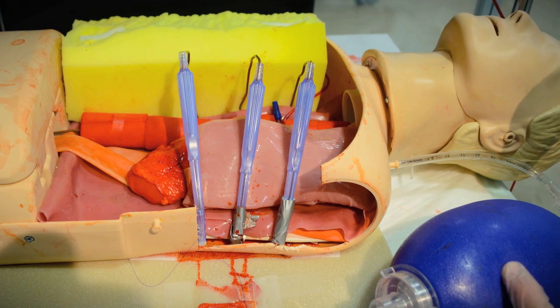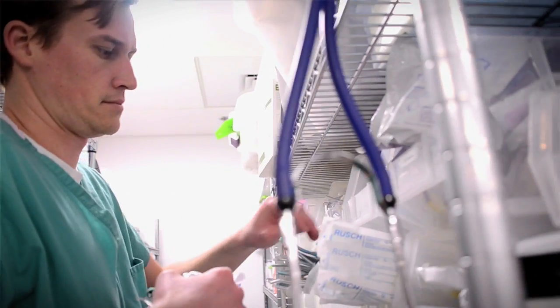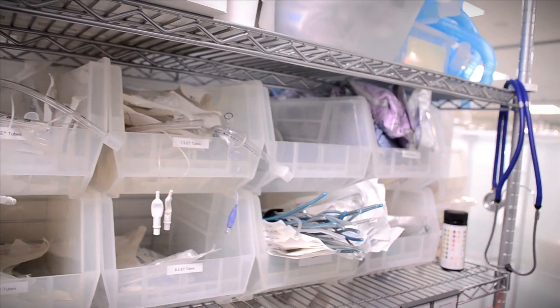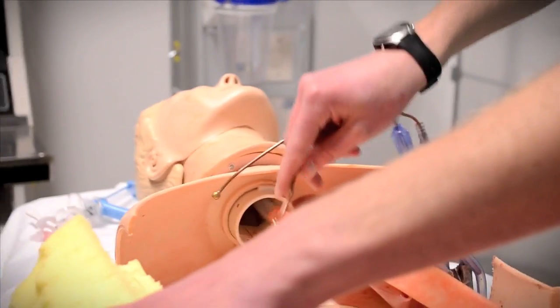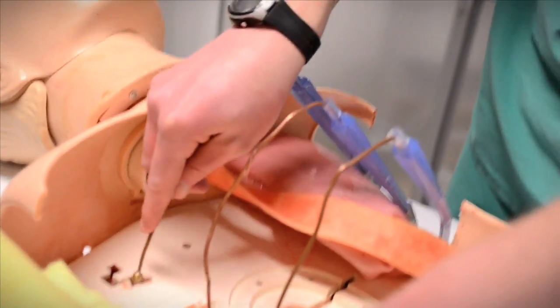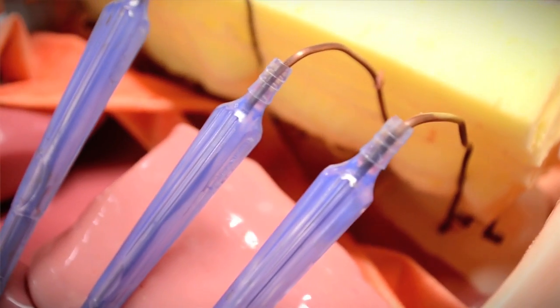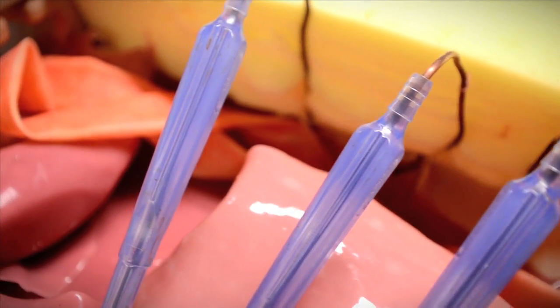The nice thing about this was that we used primarily — about 95% — things that we had that were hospital products. We used ET tube styletts and Yankauer suction catheters to simulate ribs. We inserted the ET tube stylet into the suction catheter and then drilled the suction catheter to the base of the CPR mannequin. By doing this we were able to fold the whole rib over, and it was a pretty nice fit for the angle and how a rib should look.